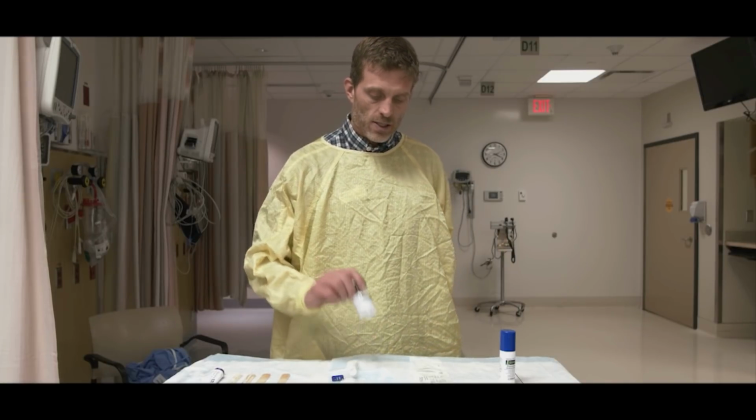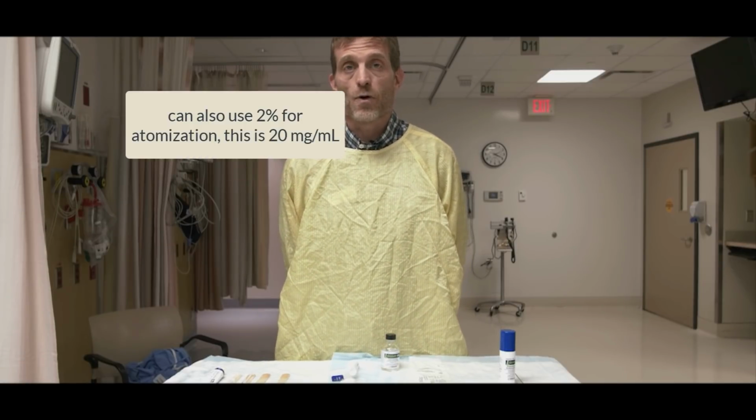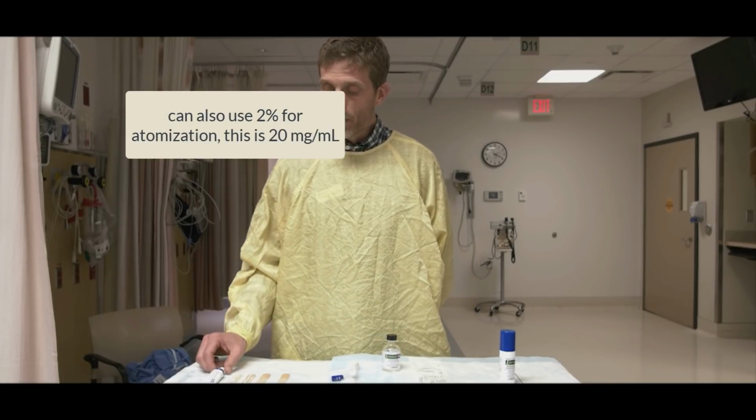But we did give him 1 cc of 4% lidocaine, which is 40 milligrams. 40 milligrams per cc, that's what 4% is. So we got 40 milligrams in the nebulizer. And then we went to the ointment.